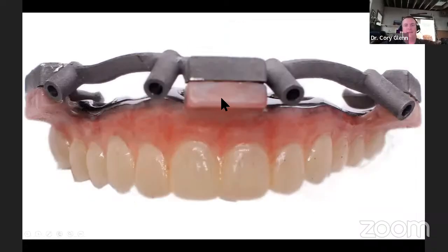All right, and it's basically not visible from the patient's perspective. It's just the intaglio of this restoration. Okay, so again, I would challenge people, what is the mode of failure of this? Because I can tell you, I've got some of these that I have taken my hand to and tried to break them like a horseshoe. I've tried to squeeze molar to molar. I've tried every which way to break these, and it's virtually impossible.